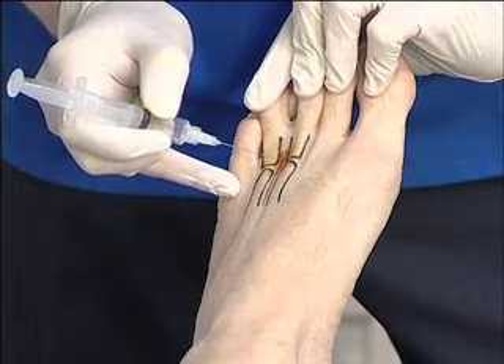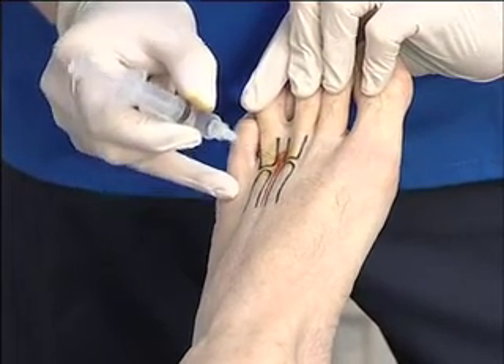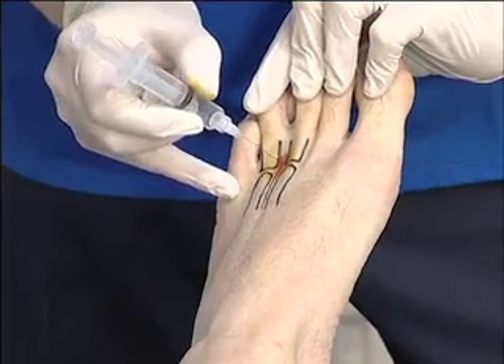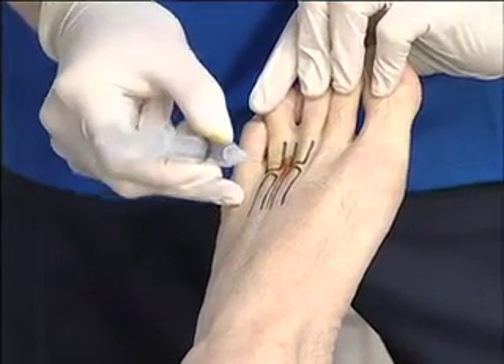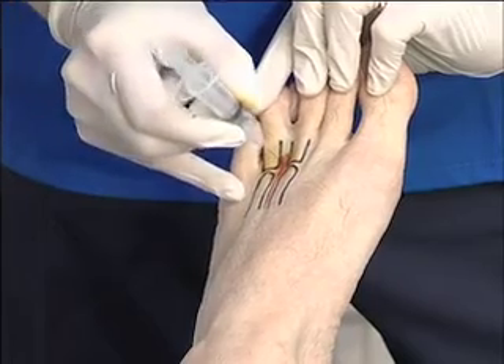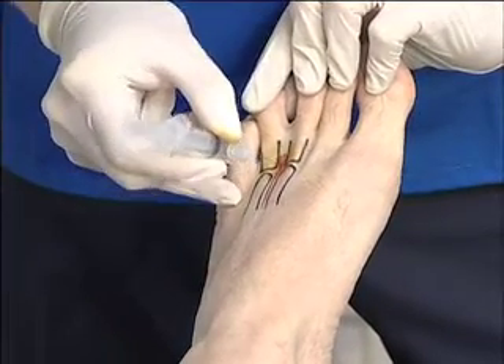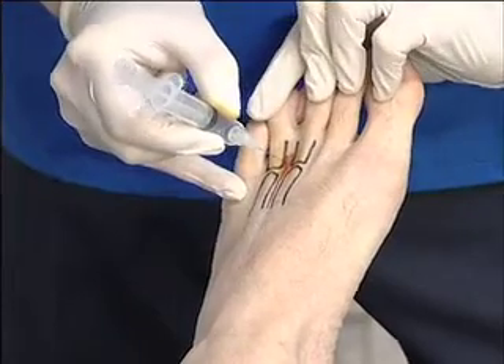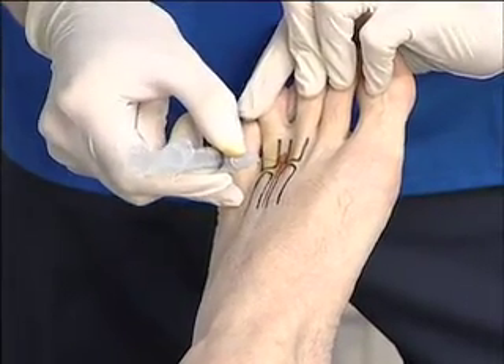It's a little scratch into the skin, and really talk to the patient — say that you're looking to advance the tip of the needle to try and contact and touch the nerve. Gently go through the deeper structures, and you will often find the deep transverse metatarsal ligament in this area. Just feel the ligament there.